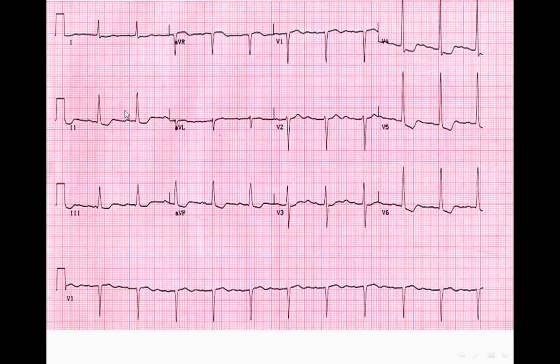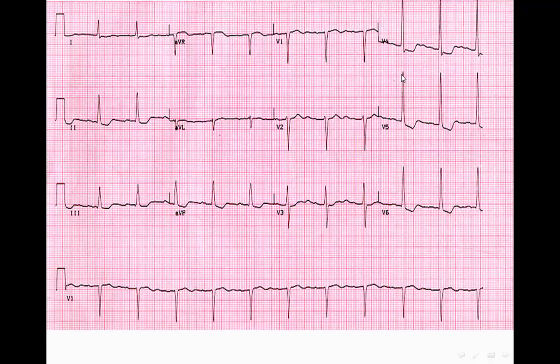Here the axis is normal, but there is high voltage in the chest leads. If we calculate the sum of the S wave in V1 plus the R wave in V5 or V6, we count 1, 2, 3, 4, 5, 6, 7 — and the sum is more than 35 small squares, or 7 big boxes. So this is a case of LVH.